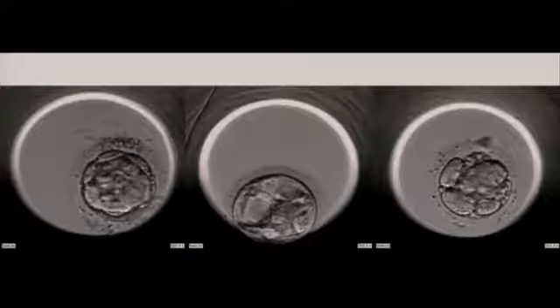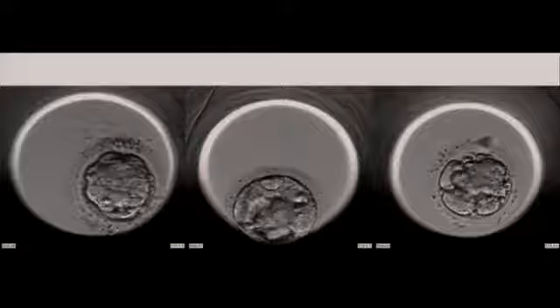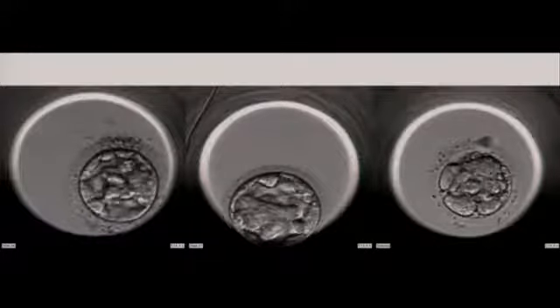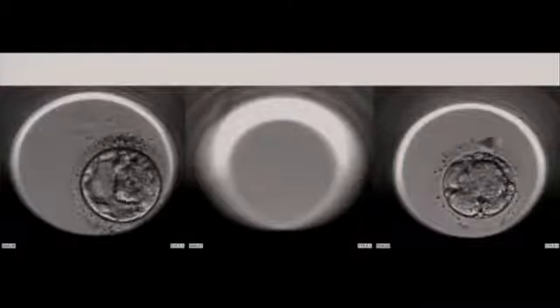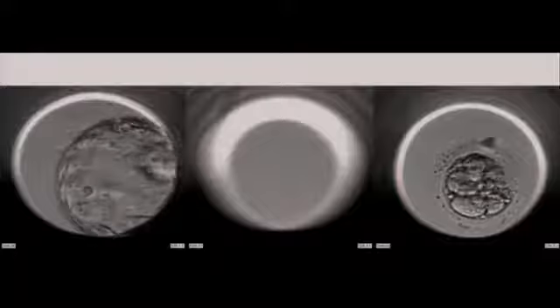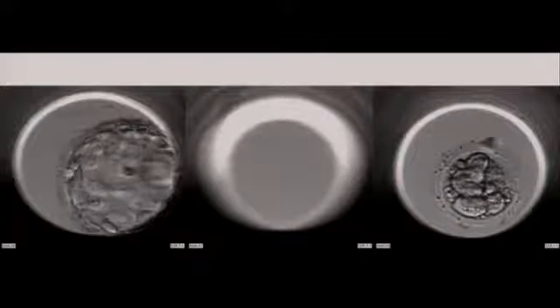So what happens with these is the one in the center actually on day 5 becomes a really nice blastocyst, and you'll see it disappear in a minute because we transferred it back to a patient and she got pregnant, luckily. And the one on the left actually becomes a nice blastocyst a bit later than the one in the center, and we actually froze it later on. Whereas the one on the right, even though it looked very similar to the other 2 embryos initially, we couldn't freeze because it wasn't very good quality.